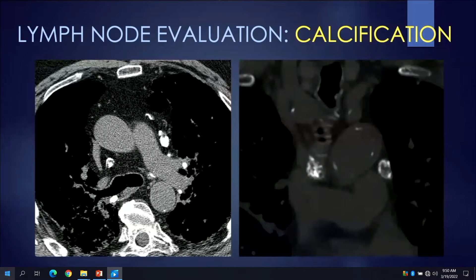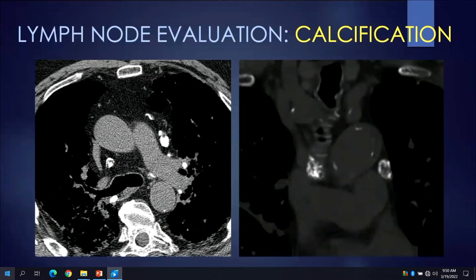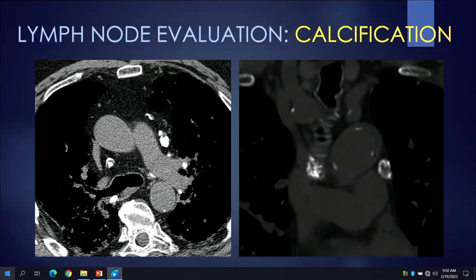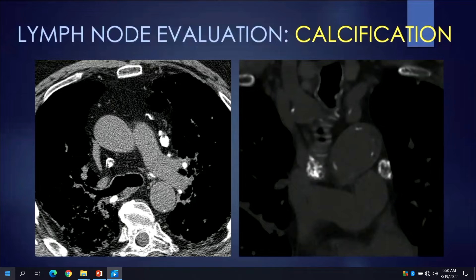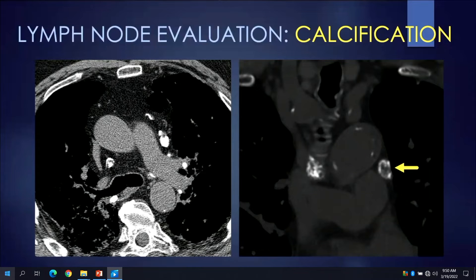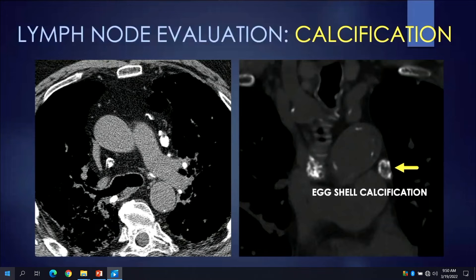On non-contrast CTs, lymph nodes can sometimes be very dense, representing calcification. The pattern of nodal calcification — which may range from punctate to complete — is usually not of diagnostic significance, except in one scenario: a lymph node showing a peripheral lamellar pattern of calcification, or so-called eggshell calcification, is characteristic of certain diseases such as silicosis.